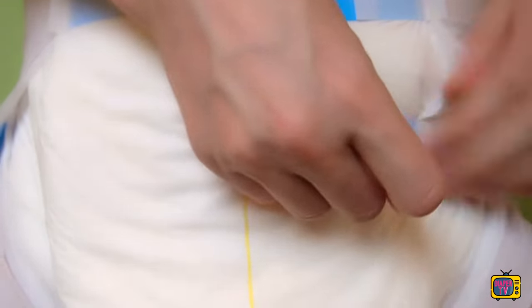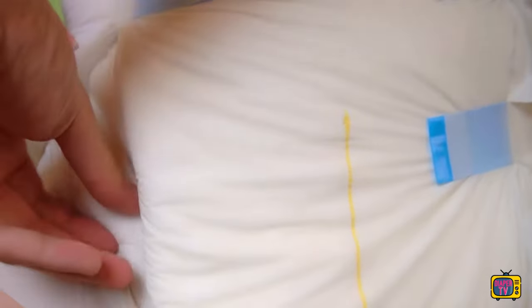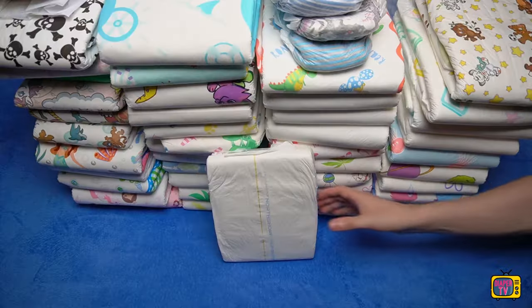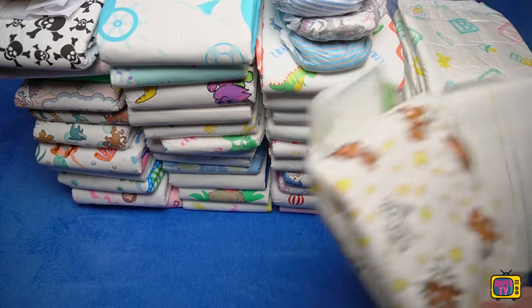All diapers with disposable adhesives have this issue, including the Better Dry or Crinkles. As with these, the same applies here. I wouldn't recommend these adhesives for beginners, but for people who are already a bit more familiar with gluing. If you have never done this before, you are better off with reusable adhesives — they can be opened and resealed several times if they don't fit properly.